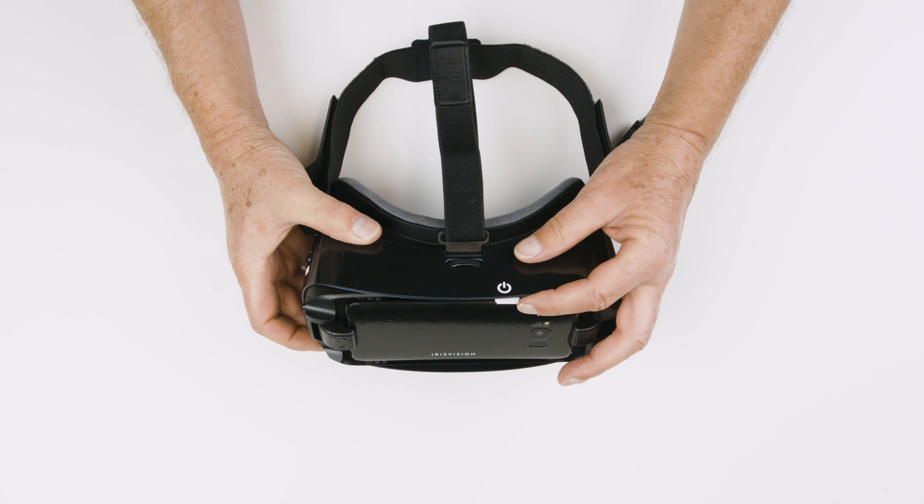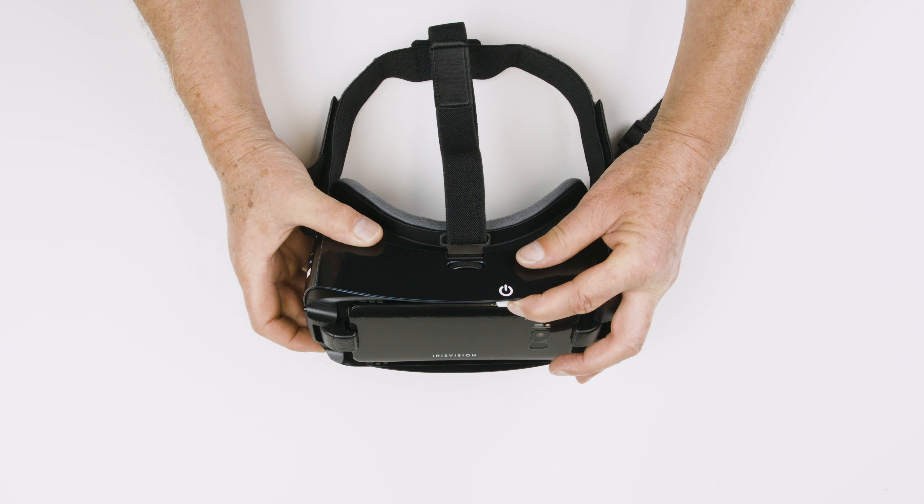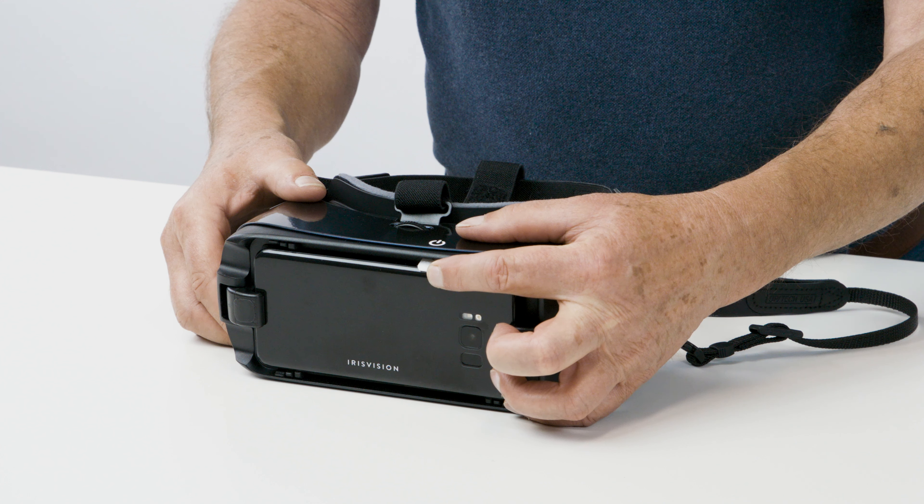To power off the device, hold down the white power tab for seven seconds until it beeps three times.